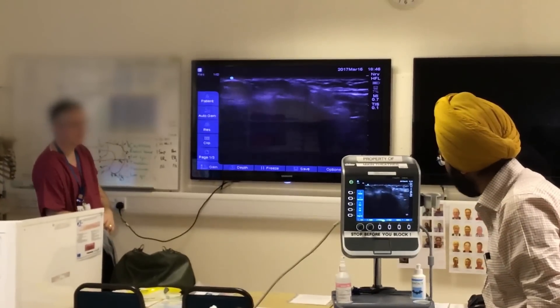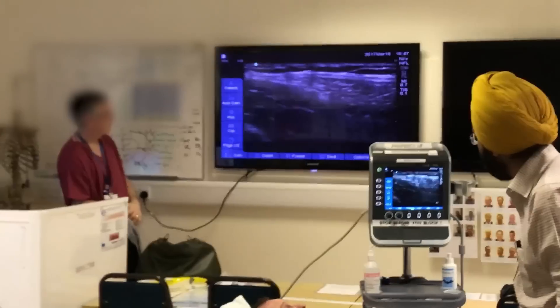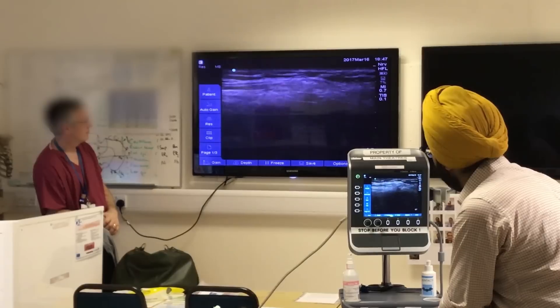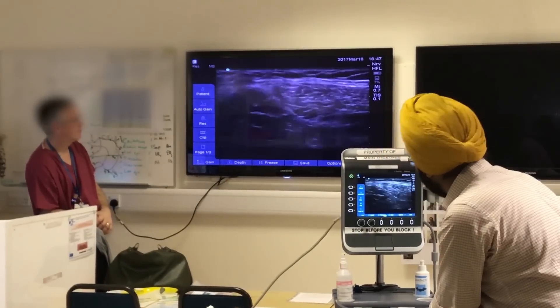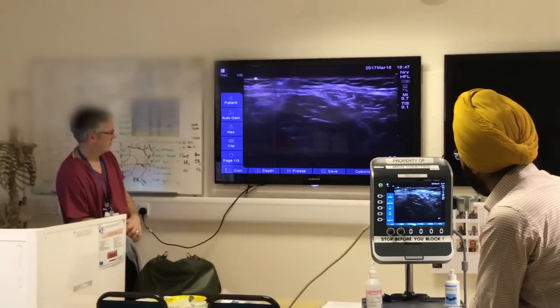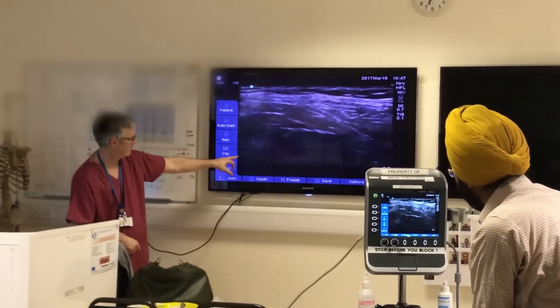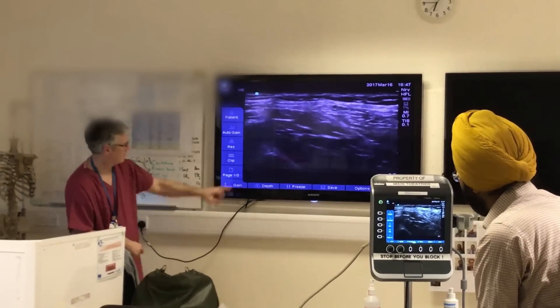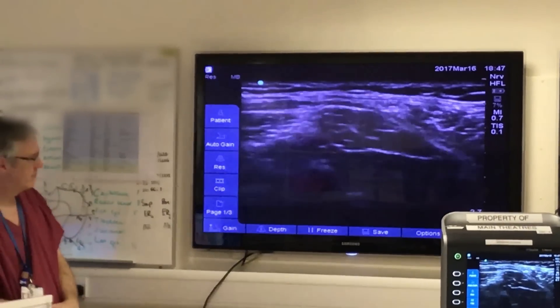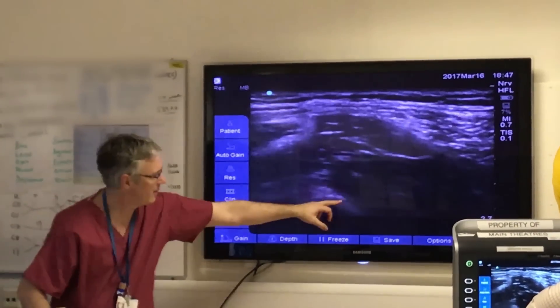Start again from the anterior superior iliac spine and just move medially until you get this kind of picture. Another landmark for confirming this picture is that the midpoint of your hourglass always sits upon a bony landmark, which is your ilium - or it could just be the anterior inferior iliac spine. You can see it better on the screen here. Try to get a nice picture and I'll pause it again for you.